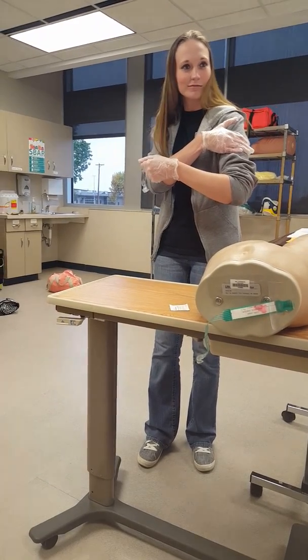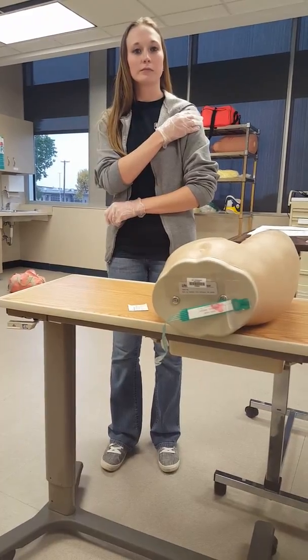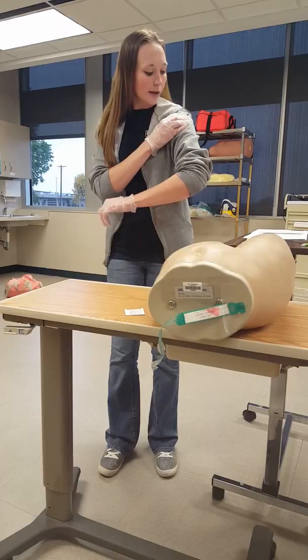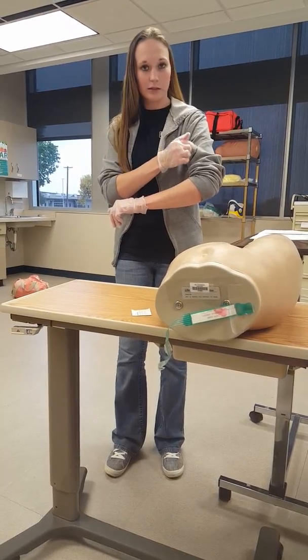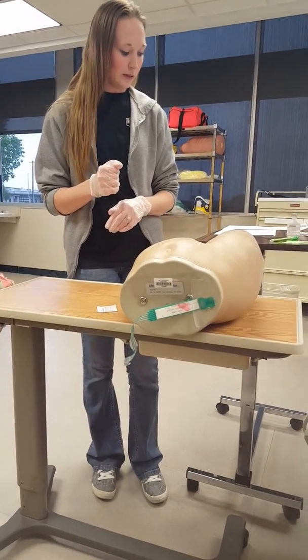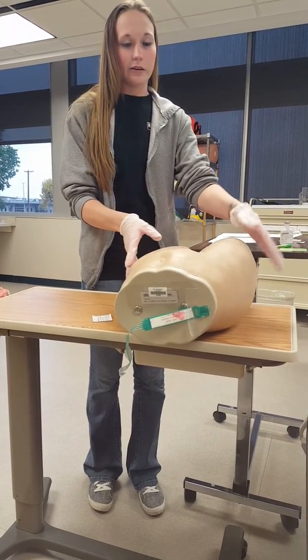But then in between the big finger, I'm trying to think. Okay, I forgot to mention that you would have your 4 fingers, 1, 2, 3, 4, and then I would give it below my little finger because my thumb would be down there, so I'd give it in this area. And then my next one would be the vastus lateralis.